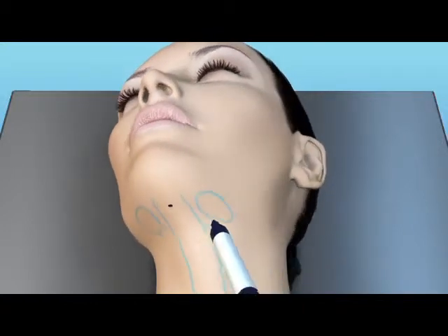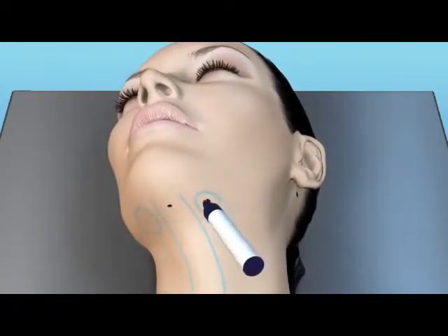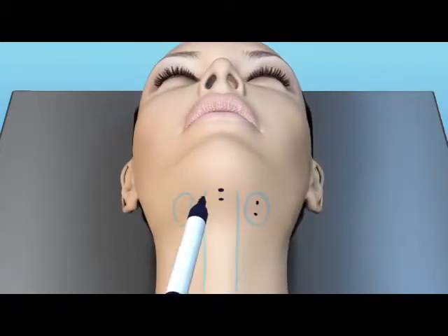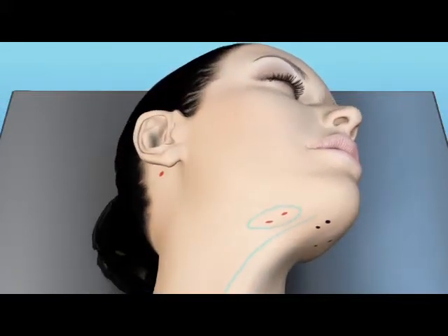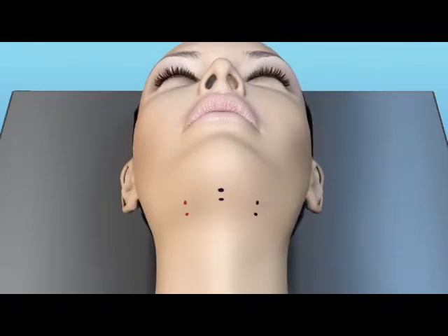This illustrates the markings of the submandibular glands as well as platysmal bands and the various pivot points for the neck-defining suture. There are 2 points over each area, 2 over the midline, 2 over each right and left mandibular gland, and 1 behind each ear, which will act as the anchor point.